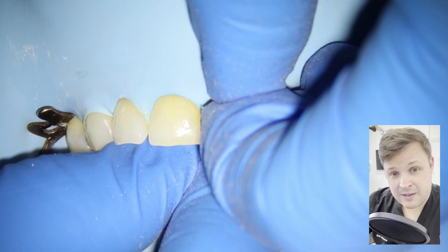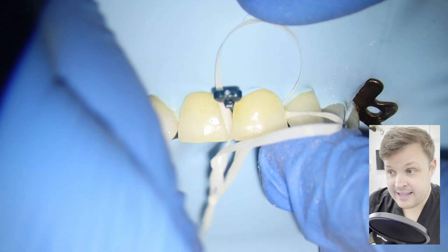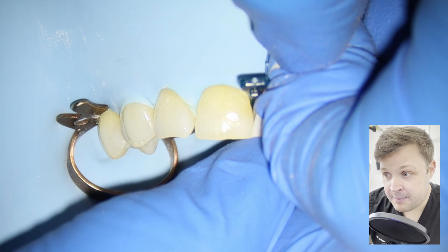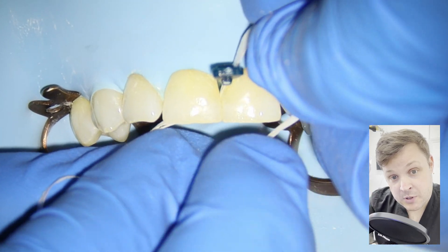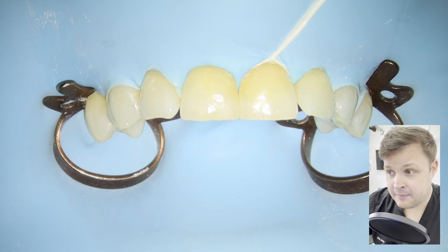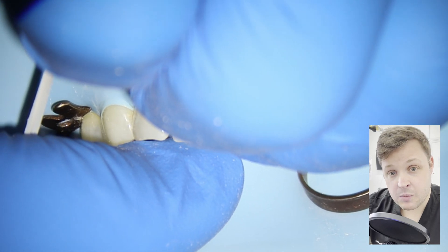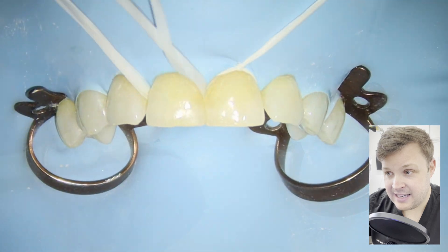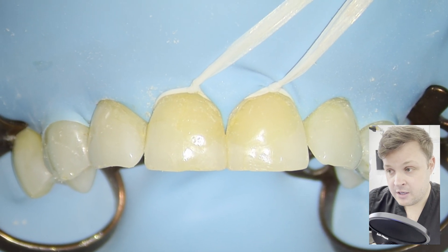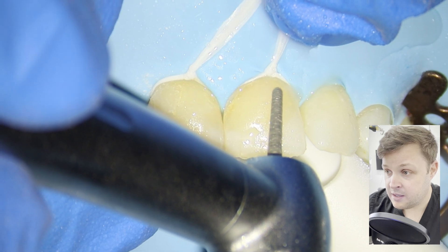We are using rubber dam. Sometimes when a filling is really close to the gum line, rubber dam can be really tough. You'll notice I'm using floss ties. In this particular case it's a bit fiddly — the teeth are too close together and I can't quite get the rubber dam in. So I'm using a small wedge just to push between the two teeth so I can get the floss tie in. I'm placing the floss tie in one of the teeth and tying it to the dam clamp, which retracts the gum and makes it easier to place the filling. When you take the floss tie away, the gum just settles back over that edge.